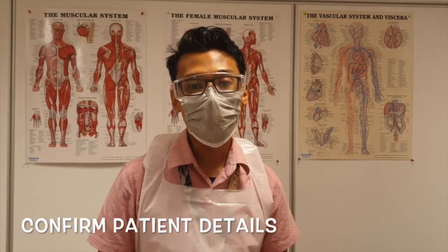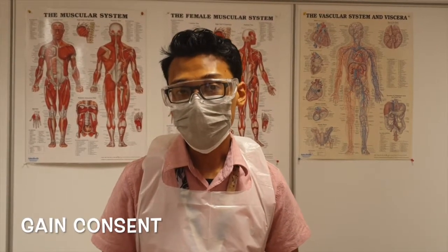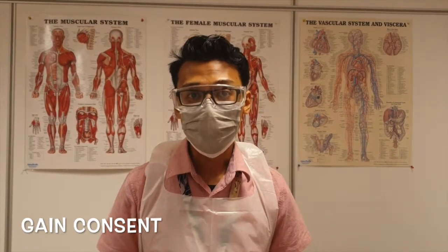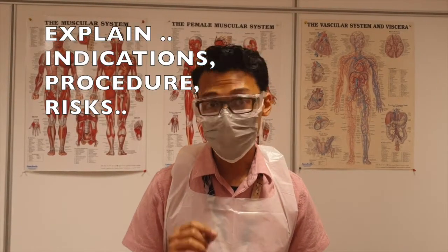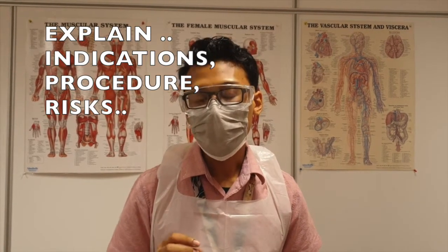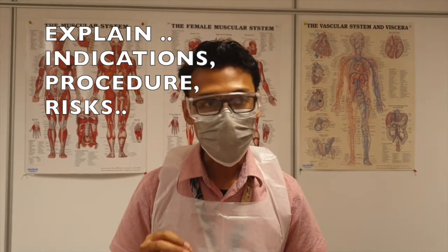And then I would like to explain to the patient in terms of the consent taking. We want to explain what we're going to do. Basically, this is to take a sample from the cervix itself. We'll be using a cyto brush, and we will need to use a speculum that will be inserted via the vagina to visualize the cervix, and from there we will take the sample from the patient. And of course, we will explain the benefits and risks that will be involved.